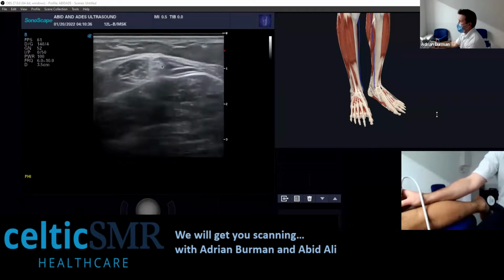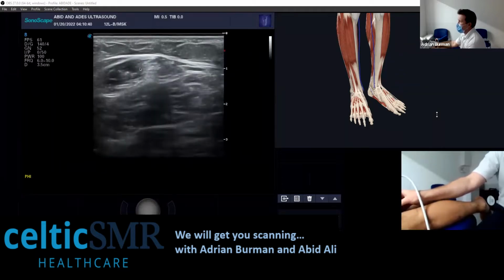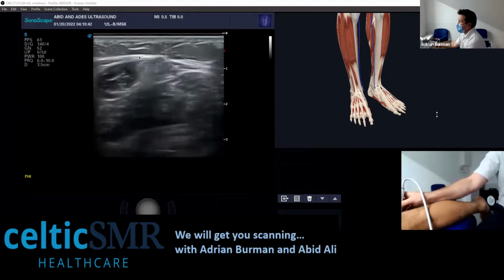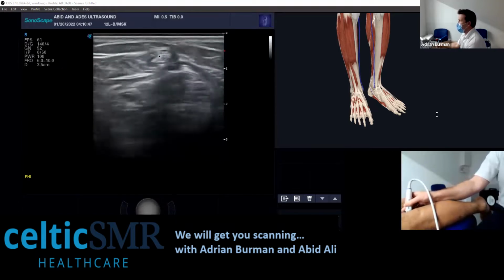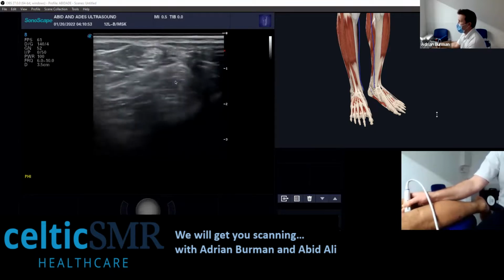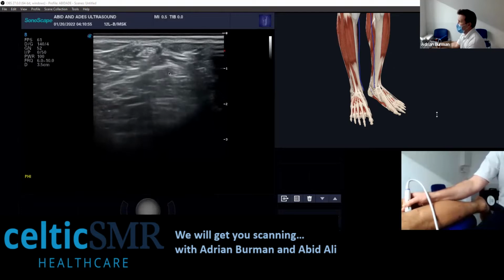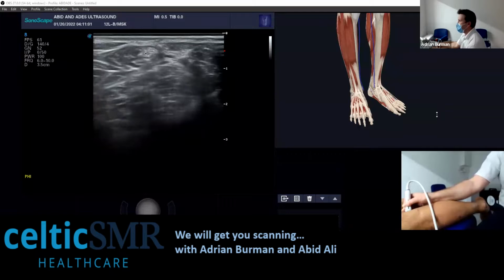Okay, if I go a little bit higher, this is the muscle belly of that. So semitendinosus tendon and then the semitendinosus muscle. And then as you come down, this sits on this muscle, which is your semimembranosus. So this is your cherry on the cake. I don't know if anyone's heard that, or your cupcake, and then you've got the cherry on the top. That's how I tend to remember it. So this is my landmark that I start off.